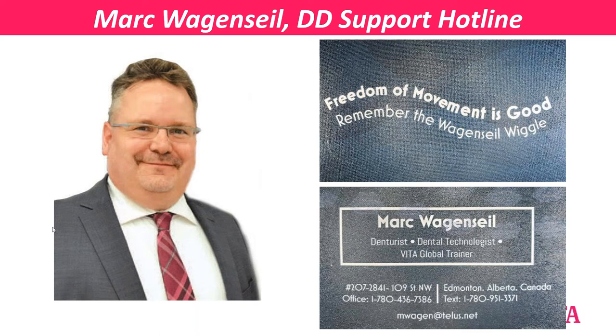So in a nutshell, if it's more narrow, you want to go a little more on the narrow side. If we have a vast expanse of space from a ridge perspective, then I can use a slightly larger tooth to fill the space up. Typically the manufacturer, because it's VITA, I know it's golden proportion together, and they started from the golden proportion theory. So I trust that, but if I'm going to override it, then I'm going to override on that specific criteria, in terms of what I feel space-wise I can get away with.